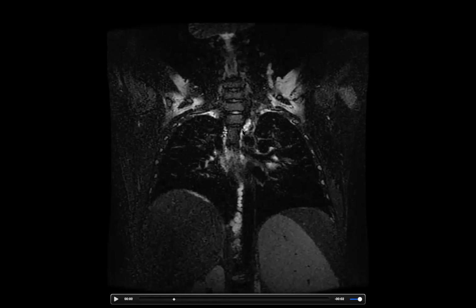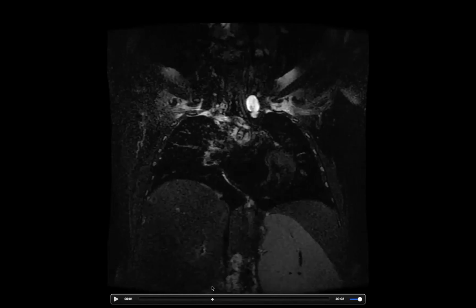And this thoracic duct will go up and it drops into the left subclavian vein here. But in this case, there's an occlusion of this duct there, so all the lymphatic tissue is just building up there. This is sometimes also called a central conducting lymphatic anomaly. And it's treatable too, so you can go in through the vein with the catheter and balloon up that area once you access it and try to bring some relief.